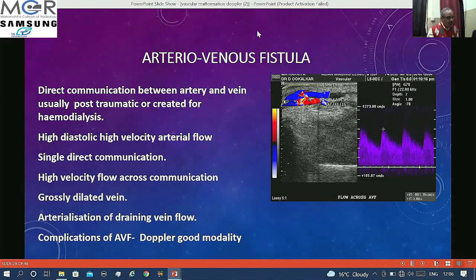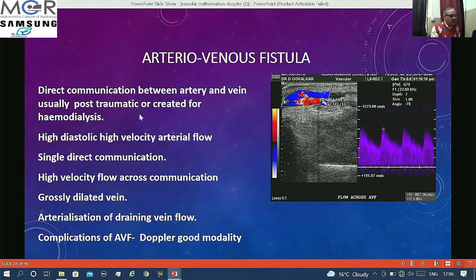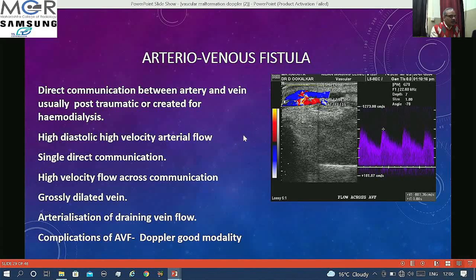AV fistulas are a type of AV communication with direct communication between artery and vein — usually created for dialysis or seen in iatrogenic or post-traumatic cases. Since there is direct communication with no resistance across it, you see very high systolic and diastolic flow. The same features apply: artery shows increased flow and the vein shows arterialization of flow.